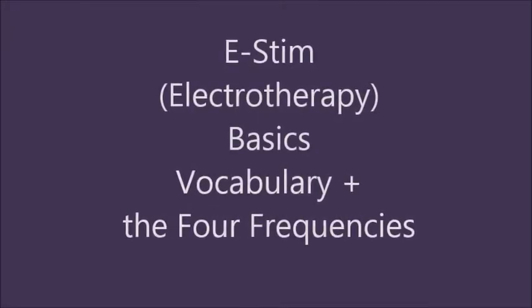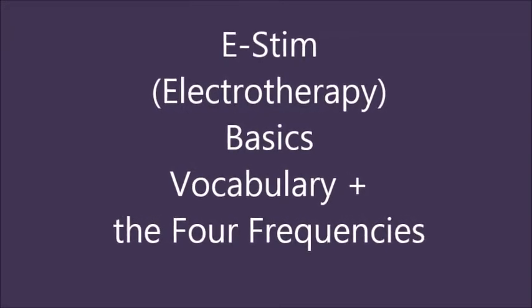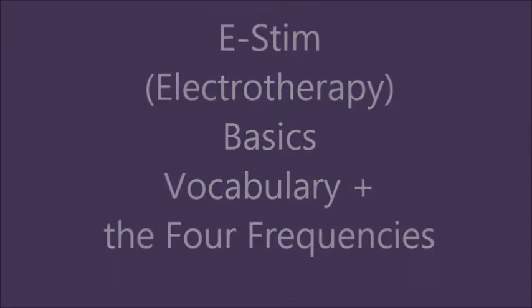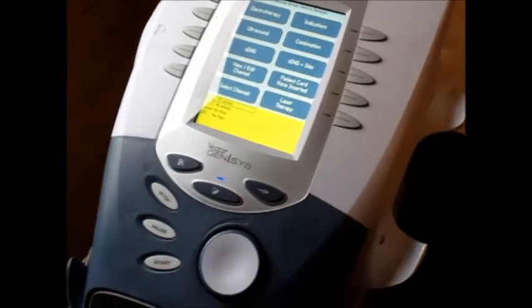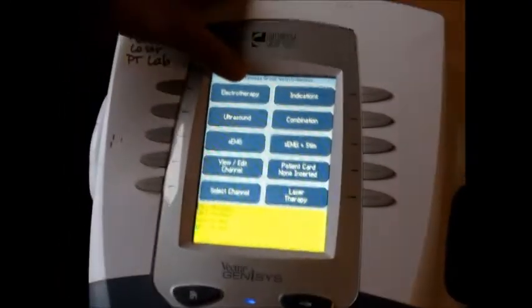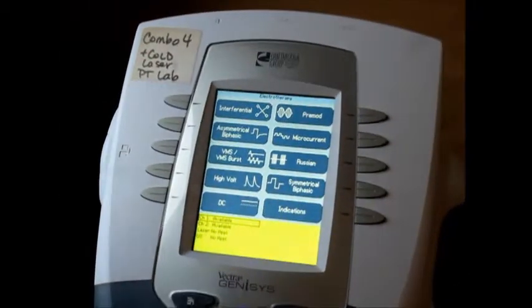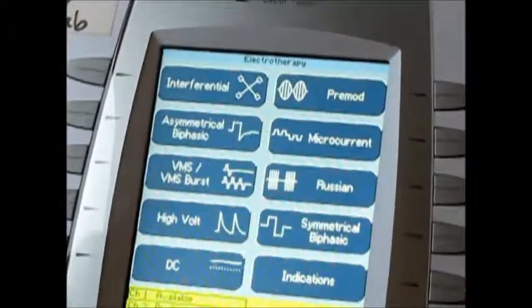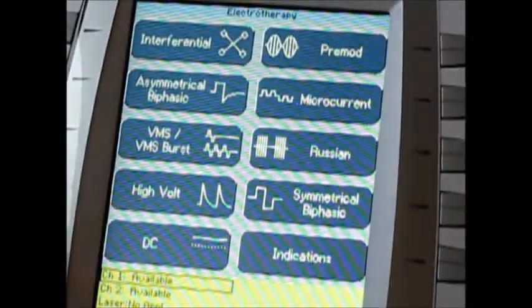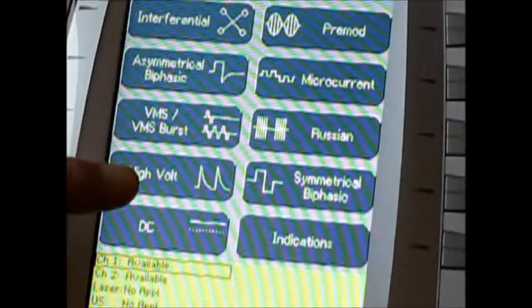E-STEM or Electrotherapy Basics, Vocabulary, and the Four Frequencies. Today I'm going to talk about electrotherapy a little bit more — pads and pad placements. This is the electrotherapy button I just pushed. These are all the choices that this Chattanooga offers. Right now I'm going to be talking about the HiVolt.